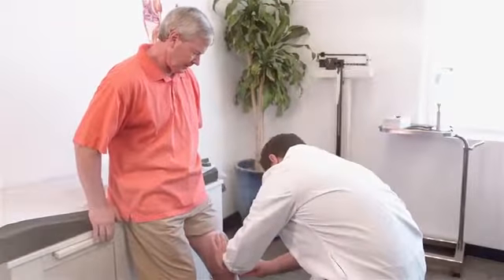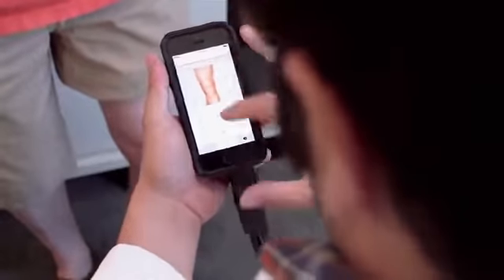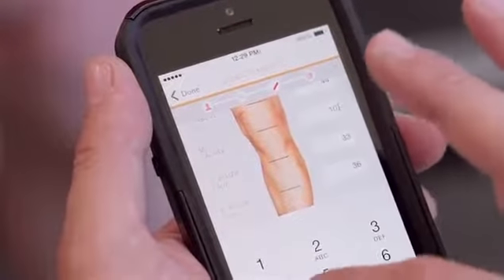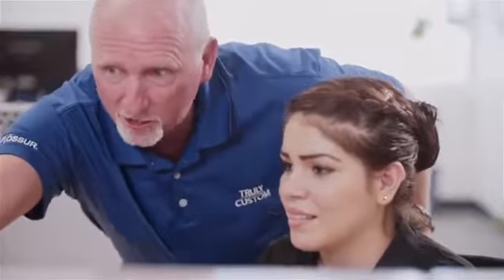You're looking for better patient outcomes, and that's what we can give you. It all begins with the data. You can capture it using one of our traditional systems, or using our SmartMeasure app. Either way, our ultimate goal is to translate the raw data you provide into an accurate 3D foam surrogate of the patient's leg.